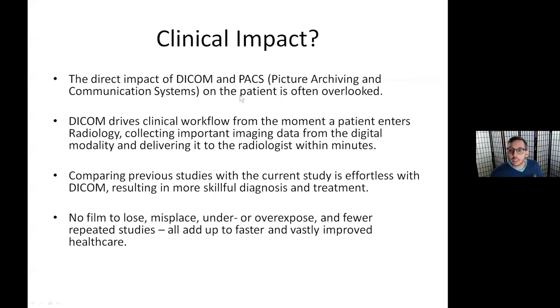So what's the clinical impact? We're talking about these standards. The clinical impact of DICOM is often overlooked. But DICOM drives the workflow. We've set out a map, and now that we've created this map with DICOM, DICOM has essentially become a map. This is how it drives how the patient interacts and how the records are kept and stored.